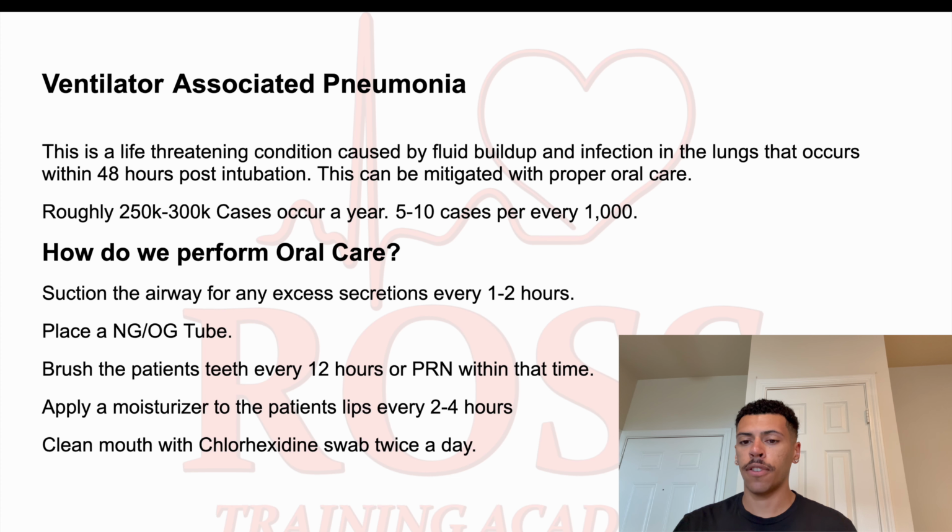So something to look out for when you throw somebody on a ventilator is ventilator-associated pneumonia, and this will typically start occurring within about 48 hours after intubation. Fluid's going to start building up and causing an infection in the lungs. But you can mitigate this by using some proper oral care. And then just a quick fact, 250,000 to 300,000 cases of ventilator-associated pneumonia happen every year.